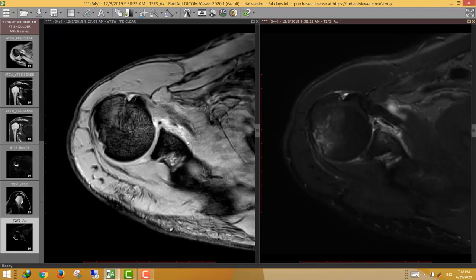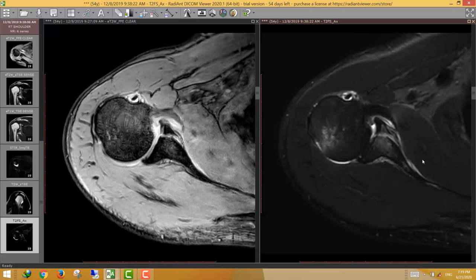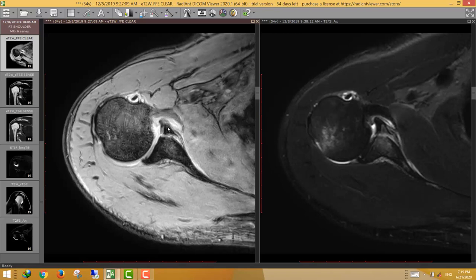This is another shoulder case in a patient with a history of dislocation. We can see an avulsion fracture of the anterior inferior glenoid labrum — not just the labrum, but the labrum and the underlying osseous glenoid. The fragment is large; measuring the width shows it exceeds 7 mm, indicating significant glenoid bone loss. This is an osseous Bankart with significant glenoid bone loss and a large separated bone fragment.